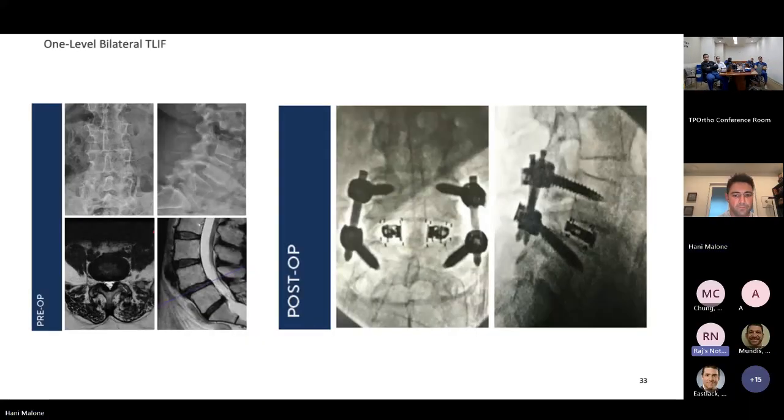And this is a better example of that, after learning that issue with getting too medial with our trajectory, coming in at a more orthogonal position and getting better position for 2 of those adaptive Flare Hawk implants.